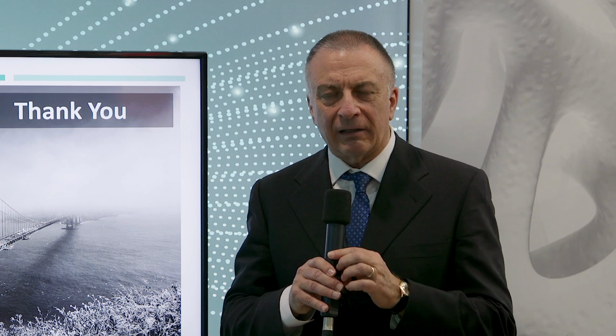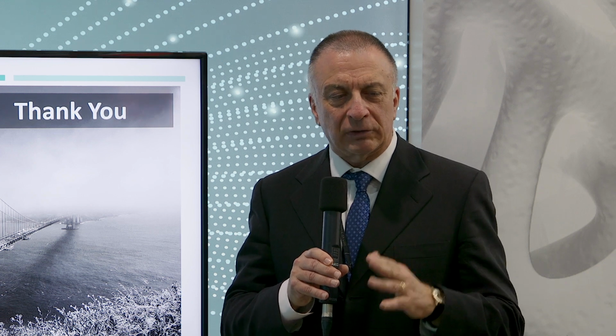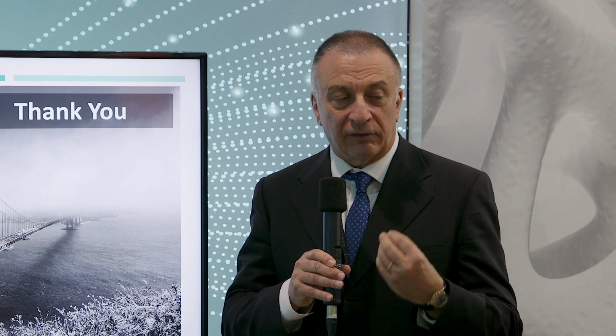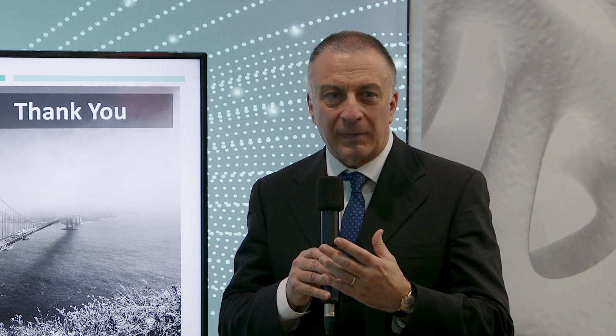For instance, I like to remember how important the impact of this evaluation is in patients with secondary hyperparathyroidism, people that undergo dialysis. In these patients, the BMD is the same normal value as in a normal subject. But when you use this new approach, you can see the difference, because we are talking about a different type of bone, not normal bone, but osteoid bone. That means the difference. And TBS is able to evaluate the porous structure of bone.